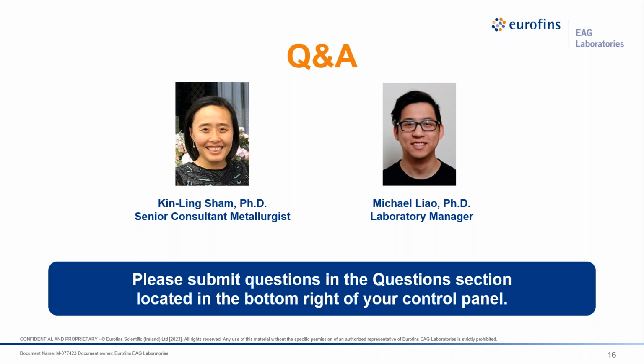ASTM F2129 is designed specifically to induce corrosion to a preset maximum voltage or maximum current density. So it's inducing corrosion damage, essentially. It's trying to test how well your medical device holds up to it. So it will not tell you over time. There's no corrosion rate, let's put it that way, that is determined.